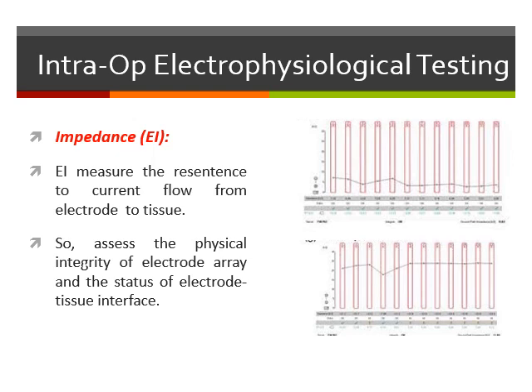might be in contact with a tissue with low fluid content, relatively low fluid content. For example, if there is a blood clot on the electrode, if there is some sort of debris on the electrode, or if, in the basal electrode, I'm making too much insertion against the muscle seal around the basal part of the electrode. So the basal electrode might be in contact with such tissue or with the muscle, and this may also be responsible for the high impedance.